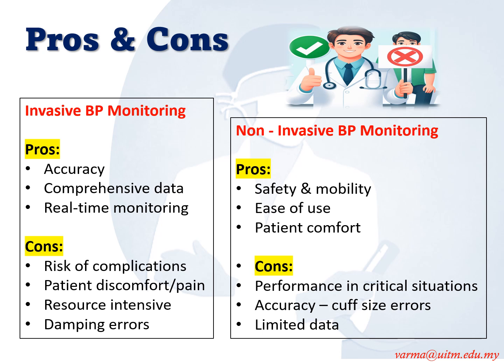For non-invasive blood pressure monitoring, it is famous and more widely used because of its safety, mobility, and ease of use. It can practically be used in any setting by any person. The choice and placement of the cuff is more than enough, especially in automated non-invasive blood pressure monitoring. Patient comfort is much better compared to invasive blood pressure monitoring.